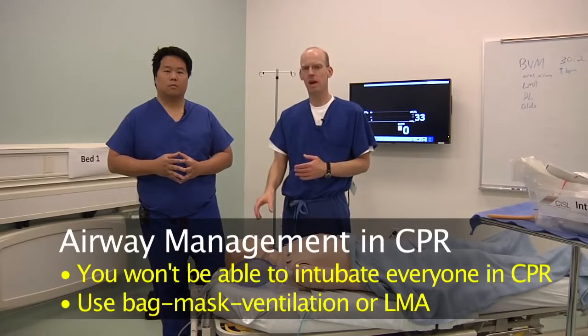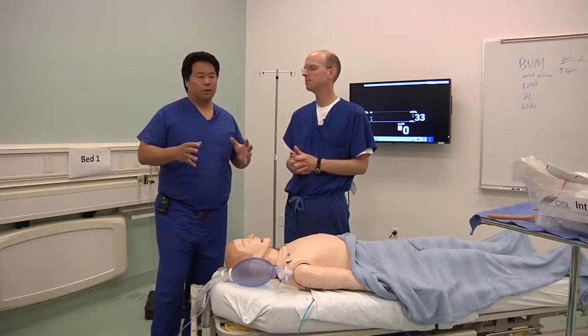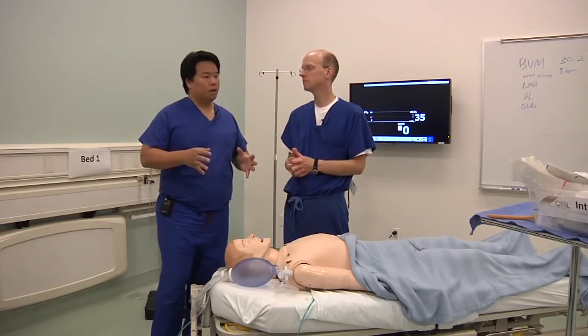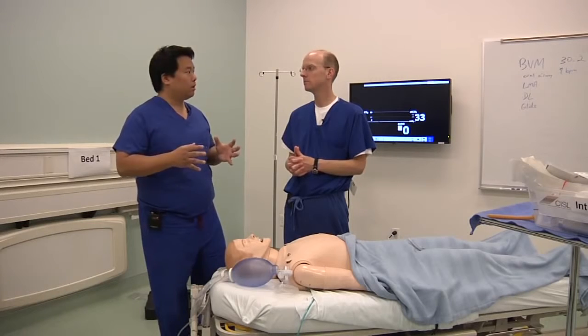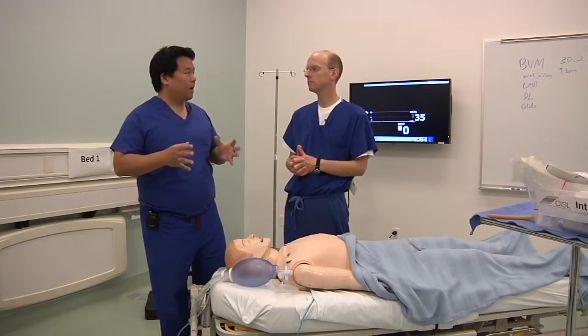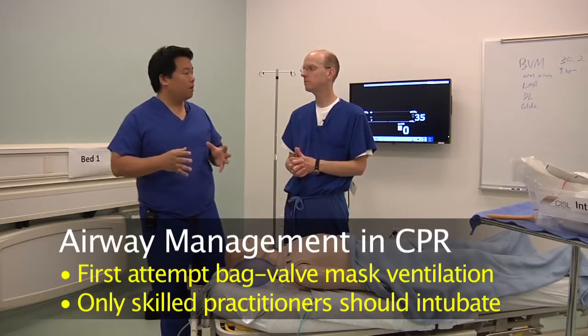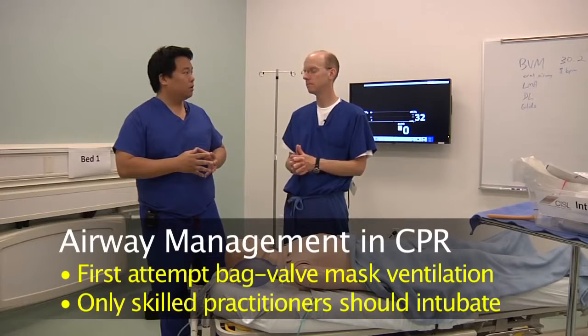So we went over bag mask ventilation before. We talked about laryngeal mask airway. So I think that's something to discuss. So let's recap a little bit. If you come into a situation where the patient is having a cardiac arrest and compressions are occurring, you should try, in terms of managing the airway, to do bag valve mask ventilation. If you can establish ventilation through that method, then you don't necessarily need to move immediately to an endotracheal intubation.